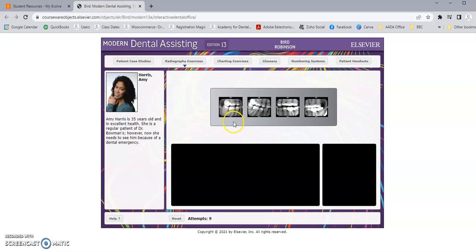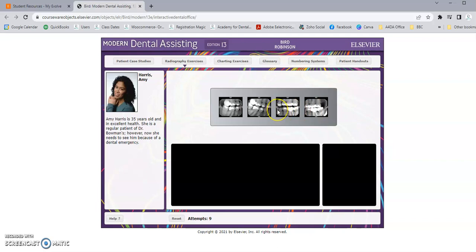For our bite wing x-rays, remember our molar shot is getting the distal of the last molar, and our premolar shot is getting the distal of the canine — that's one side. On the other side, the molar shot gets the distal of the last molar and the premolar shot gets the distal of the canine. That's how you know the difference between the molar and the premolar shot, and you can put them in place together.